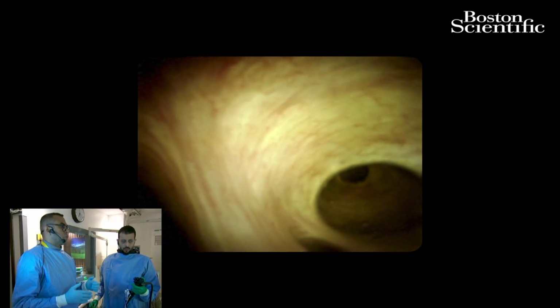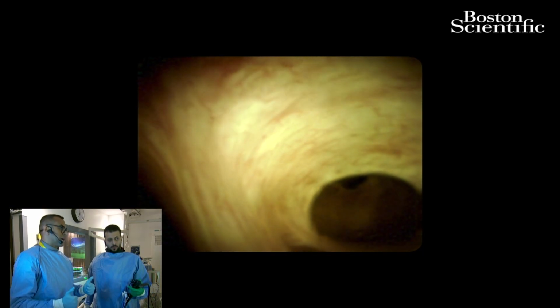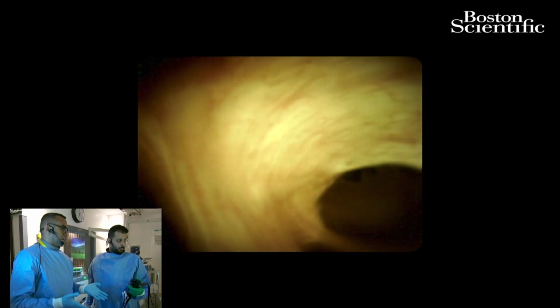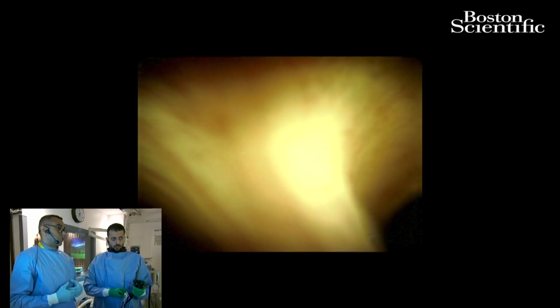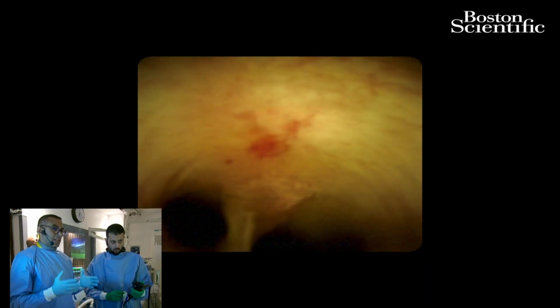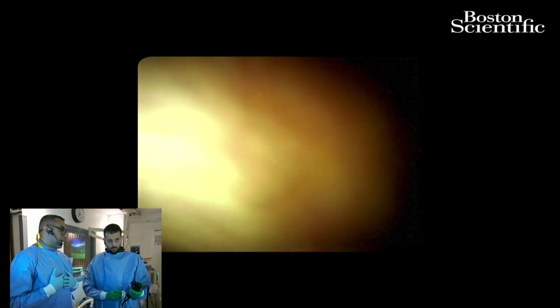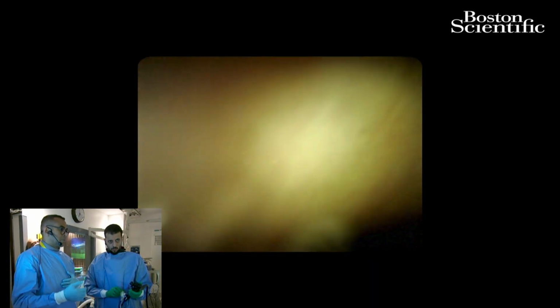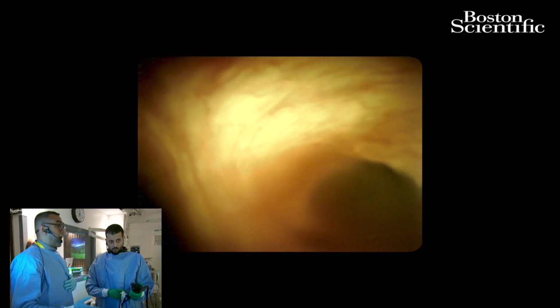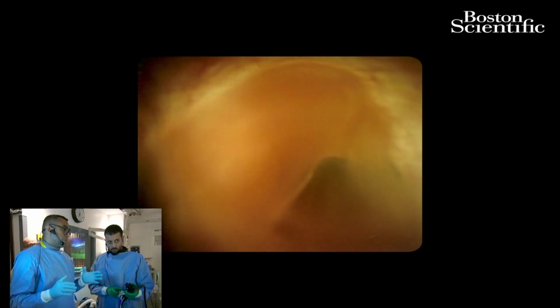But you know what, if you want to have a fact about what's behind this, seeing is believing. You must go and shed light on that location, see what it could possibly be related to, take biopsies if indicated, and you can cut the whole thing short. Listen, I had multiple cases come to me, like one of them was a post-cholecystectomy cirrhotic patient with a stricture 7 to 10 years after cholecystectomy, and there was a cholangiocarcinoma on top of the list.